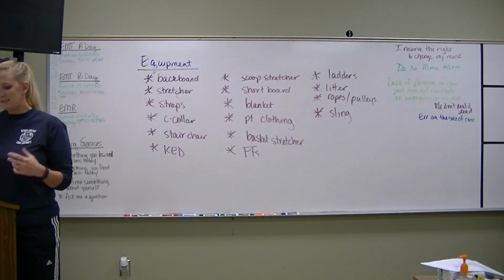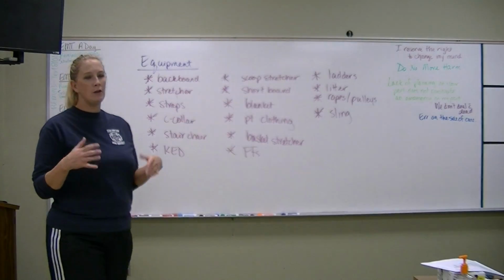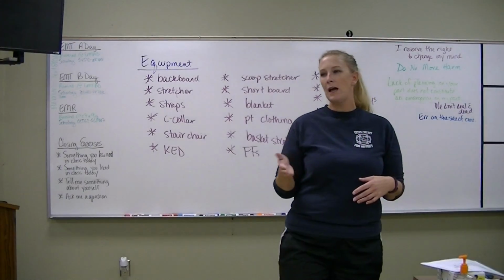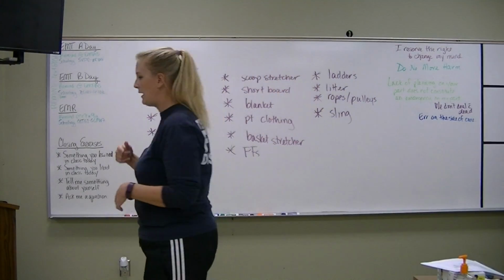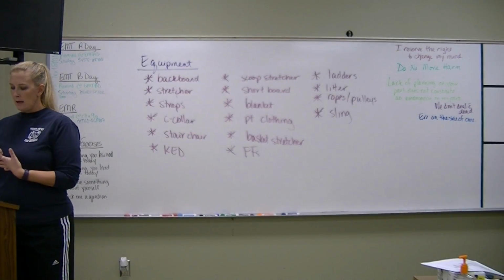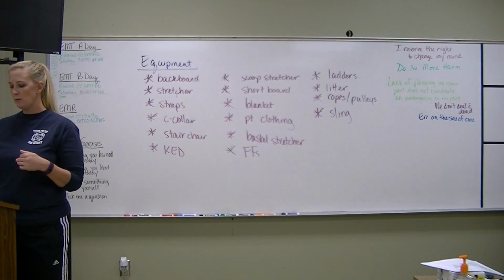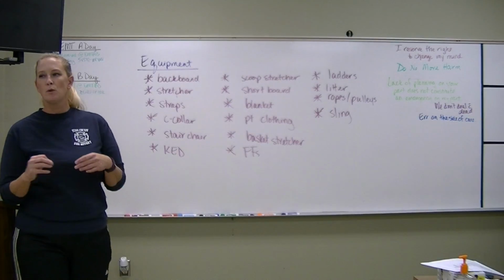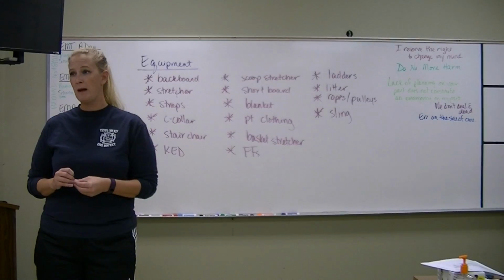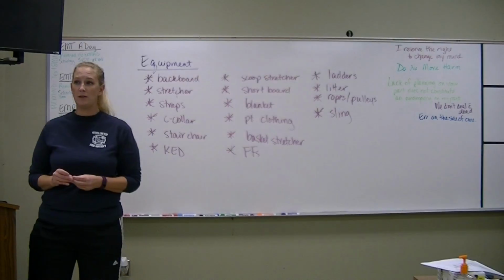Backboards are usually 6 to 7 feet long, and they're usually used for patients who are found lying down. Either lying down on their face, which is what position? Prone. Good. Or lying down on their back, which is? Supine. Good. Prone and supine. Okay. Newer backboards are made of a lighter plastic material, and they don't absorb blood or other infectious substances, so you don't have to worry as much about cleaning them. But if you are with an agency that still uses the old wooden backboards, make sure that you're taking the appropriate infection precautions before you reuse them.